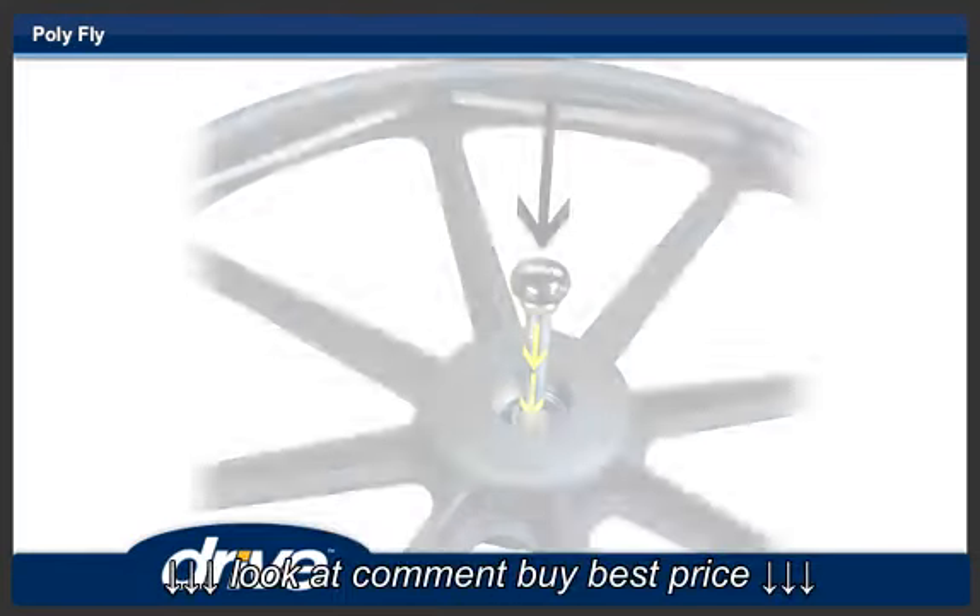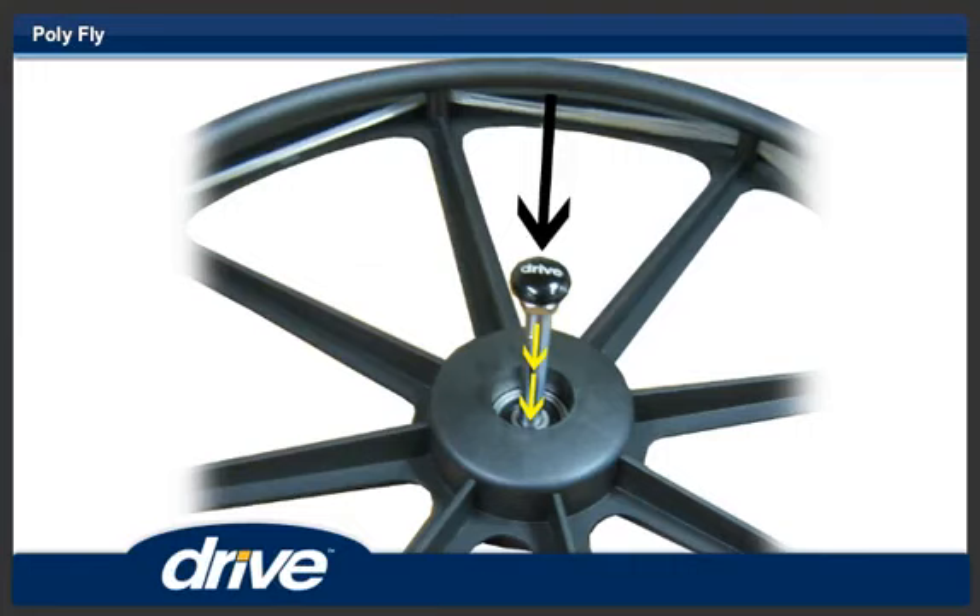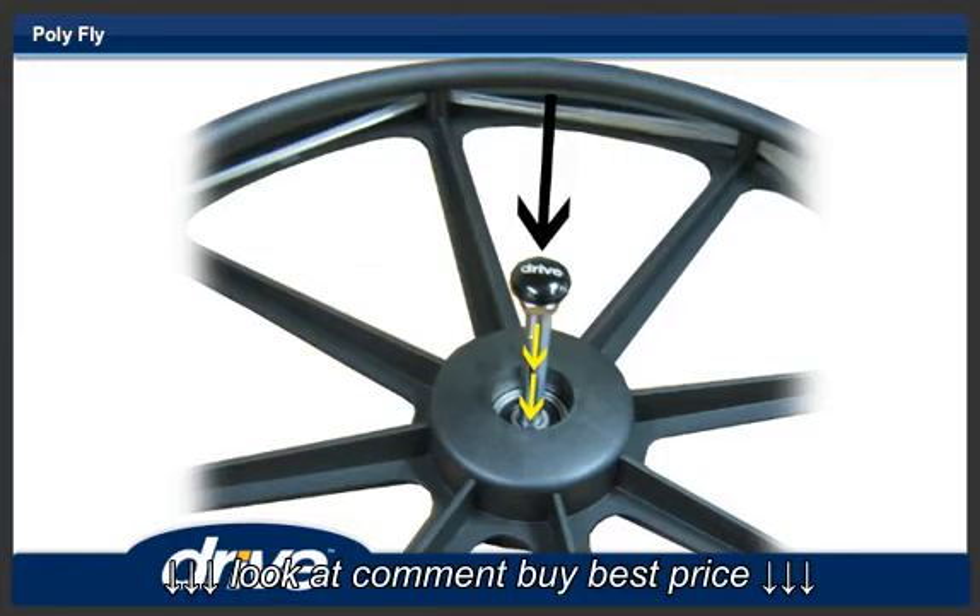Step 15. To install the 24-inch rear wheels, depress the button on the quick-release axle. Insert the axle into the 24-inch rear wheel from the hand-rim side while keeping the quick-release button depressed.